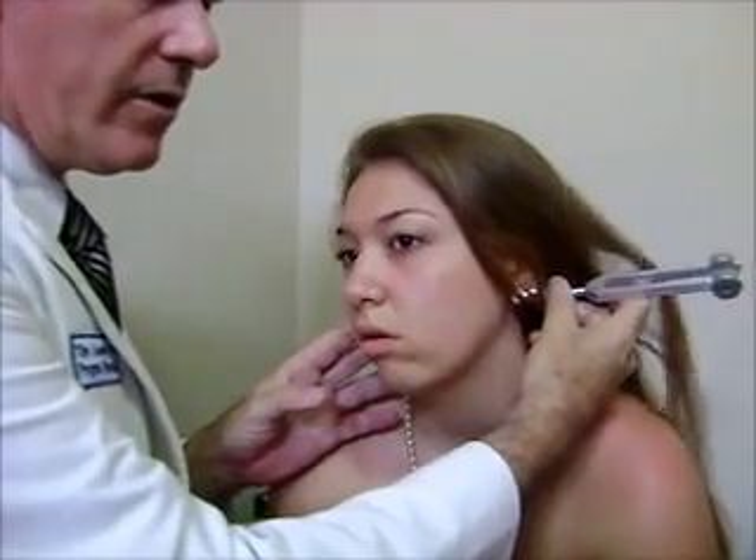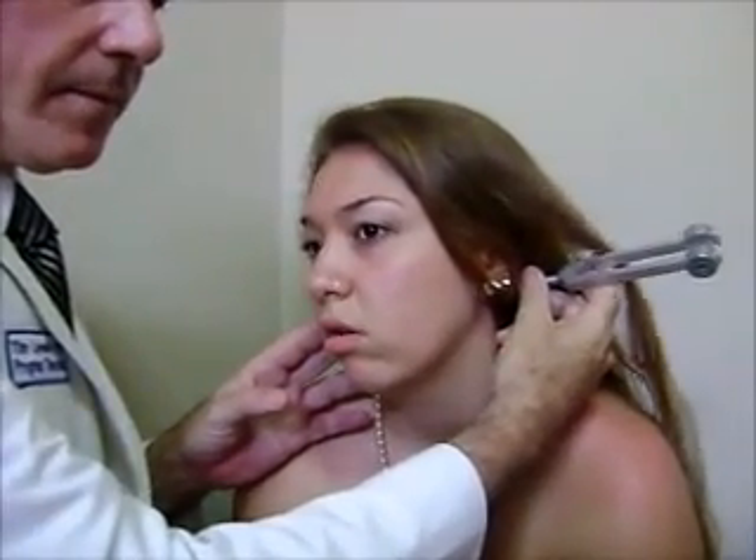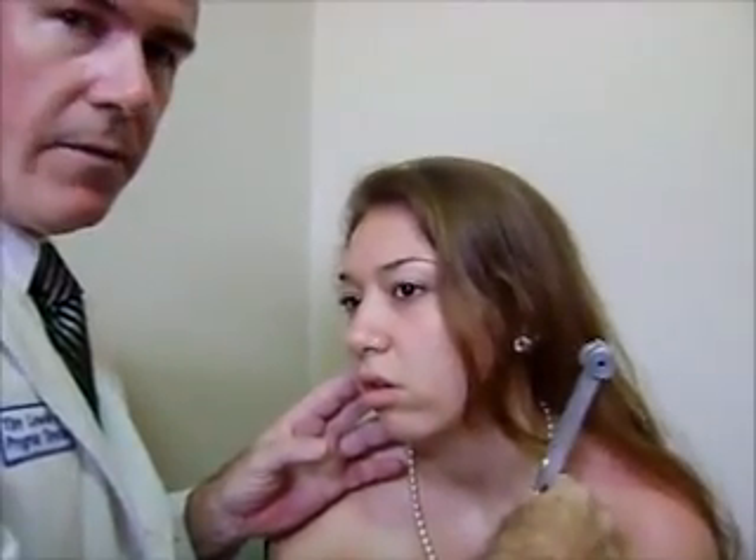Watch the difference between without using it and with, in time. First without — Erica, tell me when you no longer hear the sound. Okay. Do you hear it now? Yes. Now with the technique — Erica, tell me when you no longer hear the sound. Okay. Do you hear it now? Yes. It's faster. So it's a quick tip. We need to save seconds in our exam, and this will work really well.